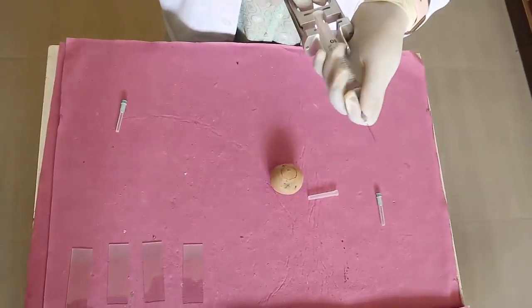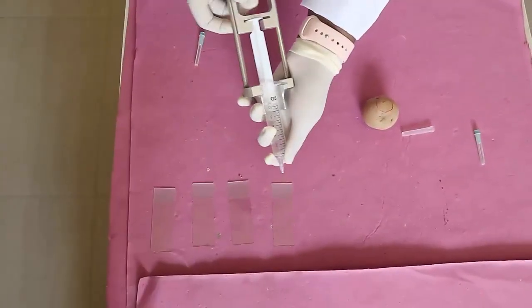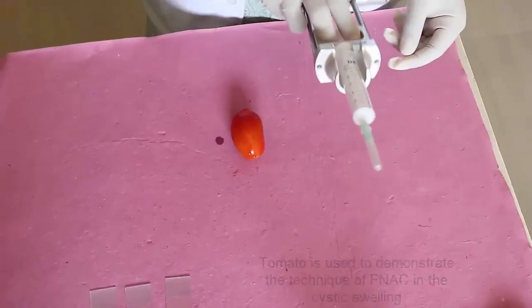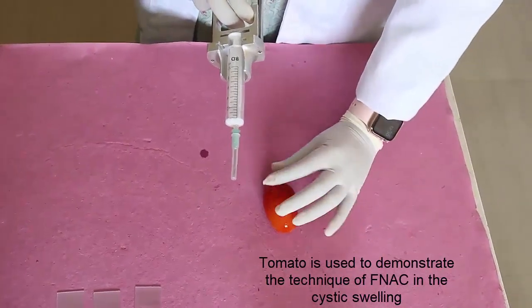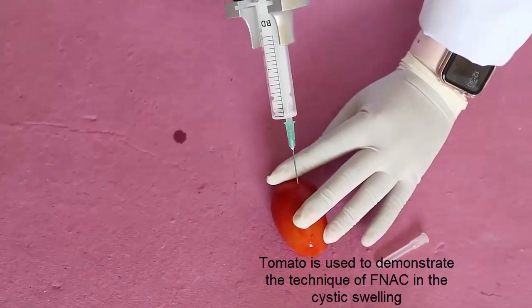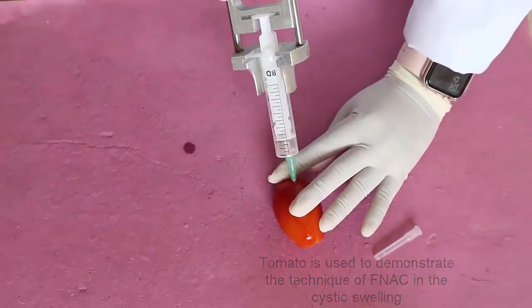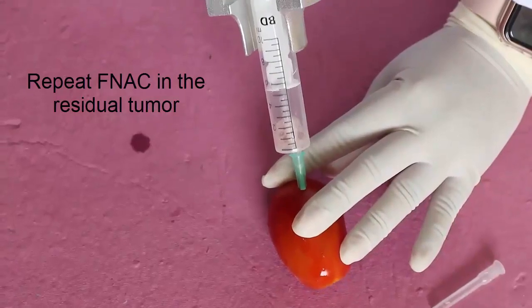The sample contained in the needle is expelled onto a clean and dry microscopy slide using air in a syringe. Let's look at the case of a cystic swelling. The lesion is palpated, fixed between the fingers, and the needle is inserted. Fluid collects in the syringe due to the negative pressure. This fluid is expelled into the sterile container for further analysis, and a repeat FNAC is done in the residual tumor.